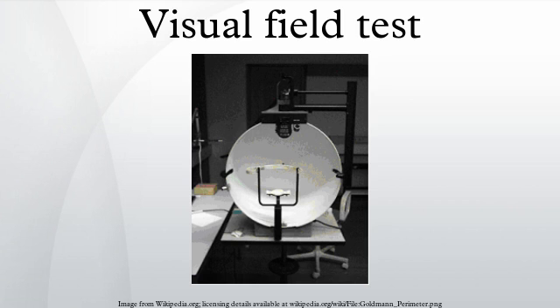Automated perimetry. Automated perimetry uses a mobile stimulus moved by a perimetry machine. The patient indicates whether he sees the light by pushing a button. The use of a white background and lights of incremental brightness is called white-on-white perimetry. This type of perimetry is the most commonly used in clinical practice, and in research trials where loss of visual field must be measured.